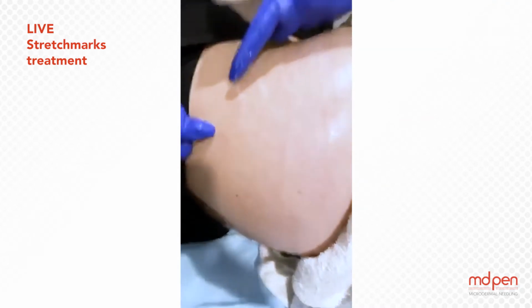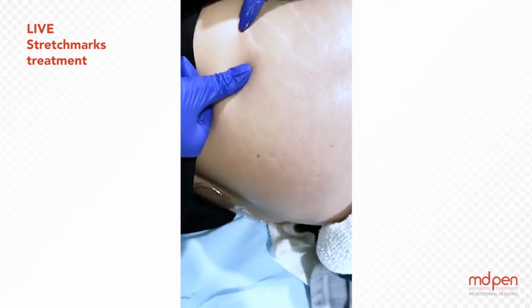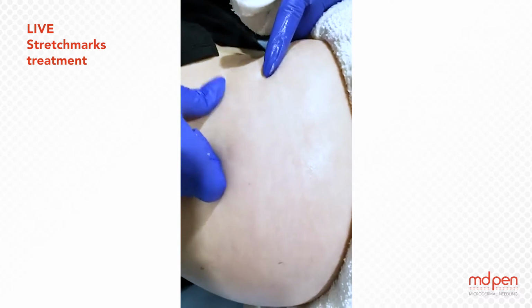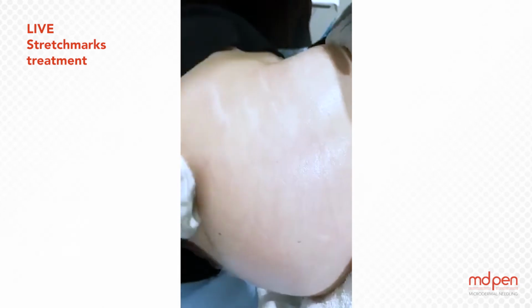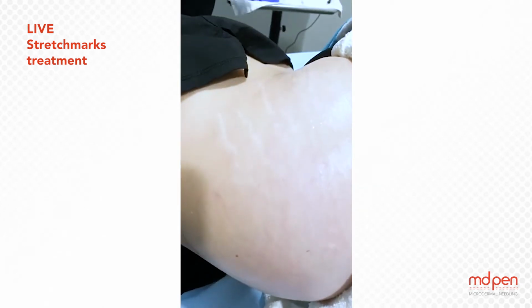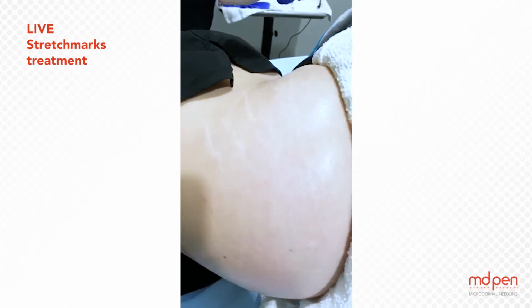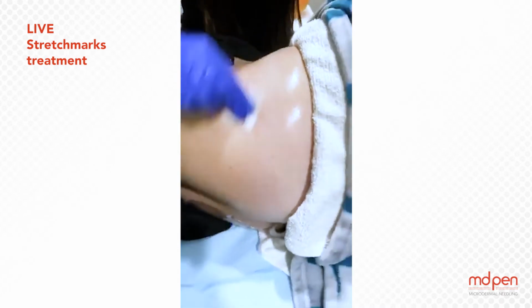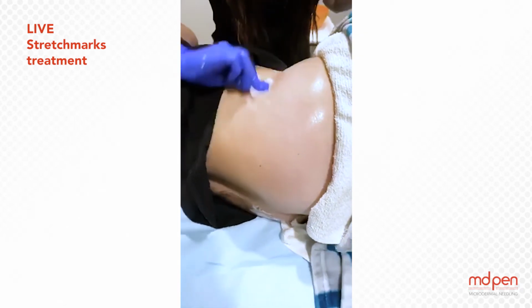So maybe you guys can see here, this is going to be a stretch mark that's new. Something that hasn't been around as long, and then you've got your more white stretch marks, which have been around a while longer. And then I am going to go over with a little alcohol pad to get any excess numbing.